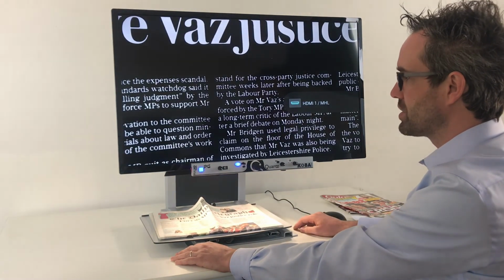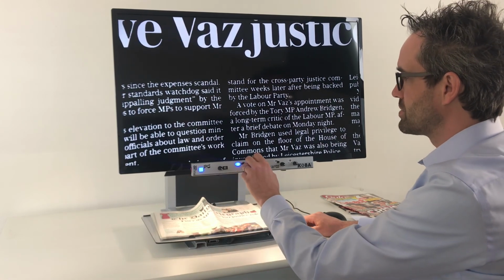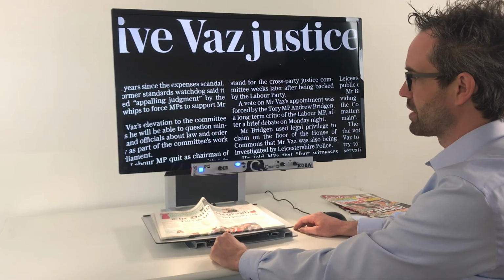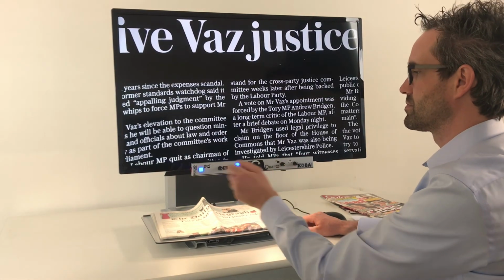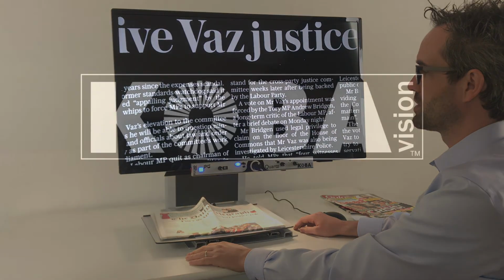Probably you will have noticed that the unit has a spoken manual. That means if you turn zoom in, zoom out, or press a button, it will explain the function of that button. White, black, photo mode, white, push for line or bar, less background, more background. So that's an interesting thing about it.